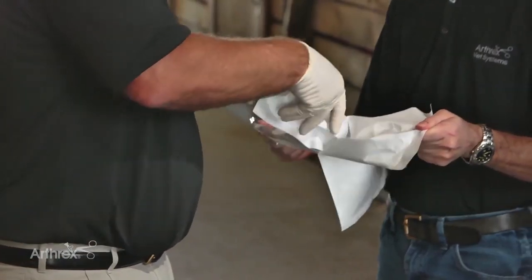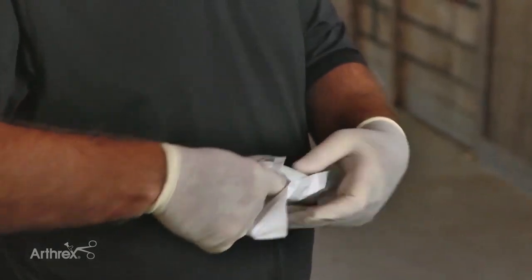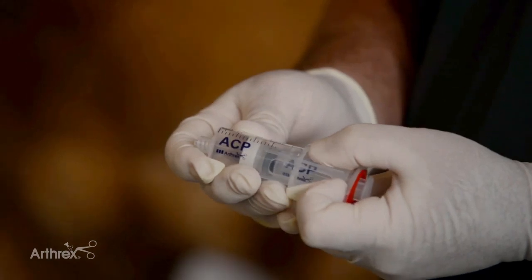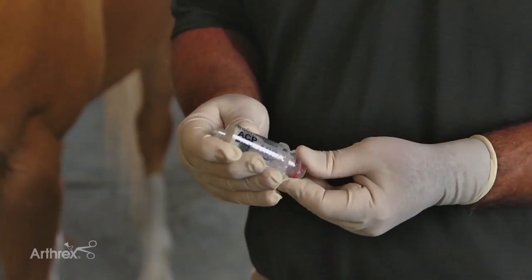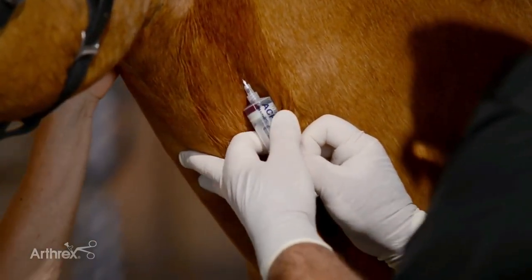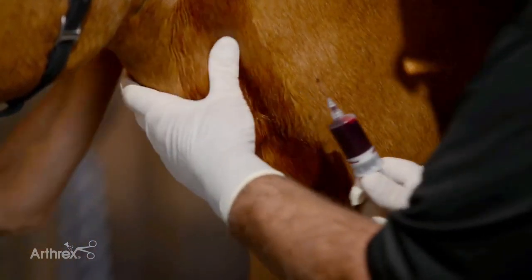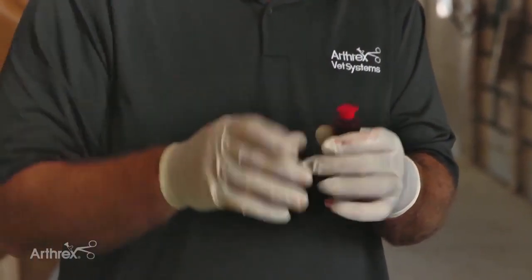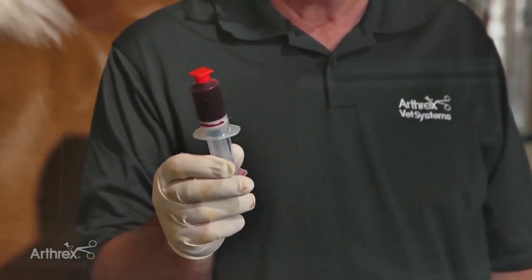This is how the ACP kit is marketed. So it's double sterile. So we go ahead and get our sterile syringe. 2 parts of the syringe, the outer and the inner. The outer harvests the blood, the inner will eventually harvest the plasma. We go ahead and harvest the blood up to the 16 mLs. Then after we harvest that, we put the red cap on and we spin it at the appropriate RPMs for 5 minutes and then harvest the resultant plasma.